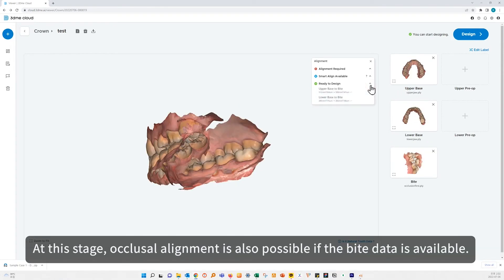At this stage, occlusal alignment is also possible if the byte data is available.